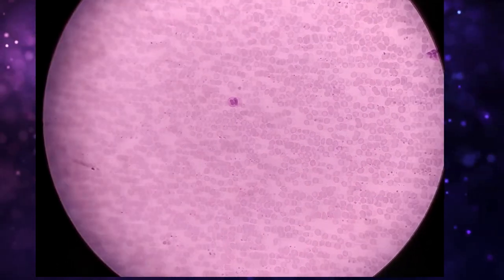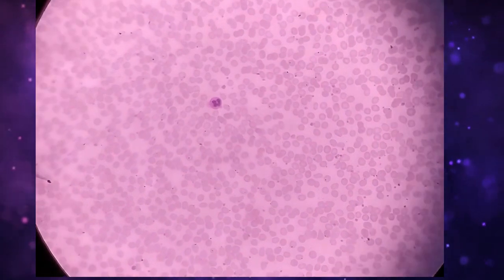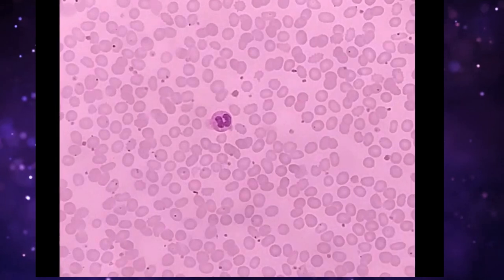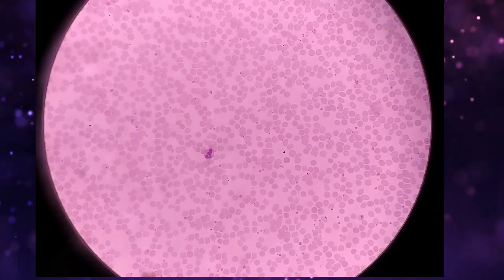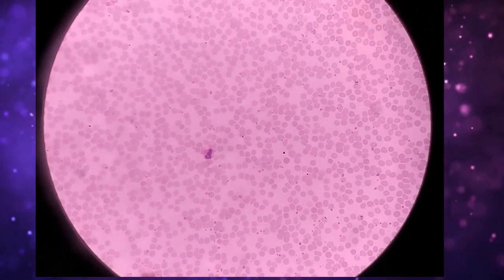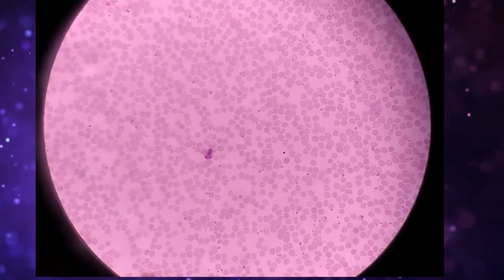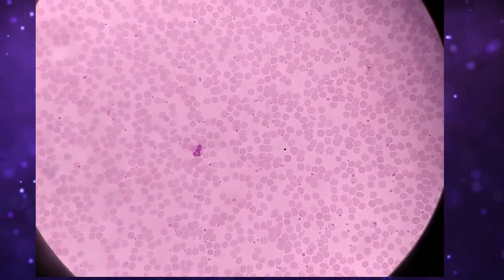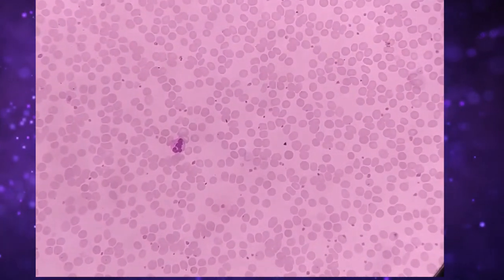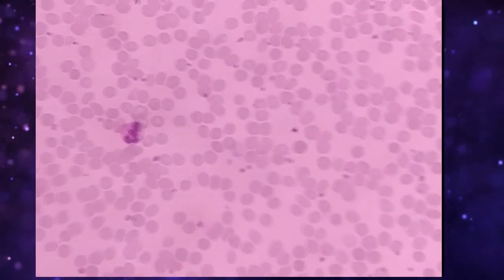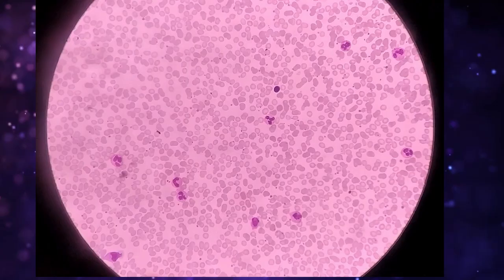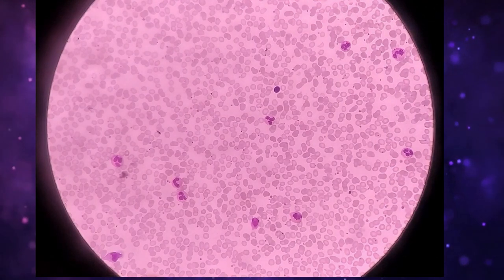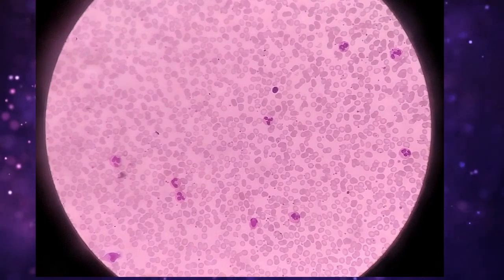Here you can see this is under 40 power magnification. Here you can see a neutrophil when I zoom in. Here you can see another neutrophil when I zoom in.